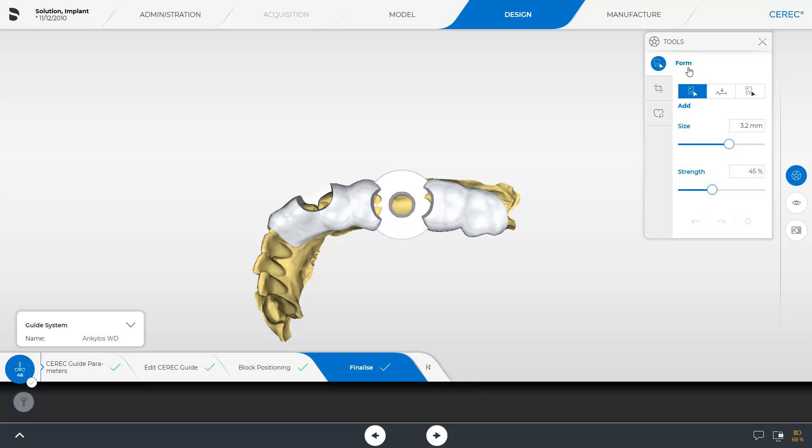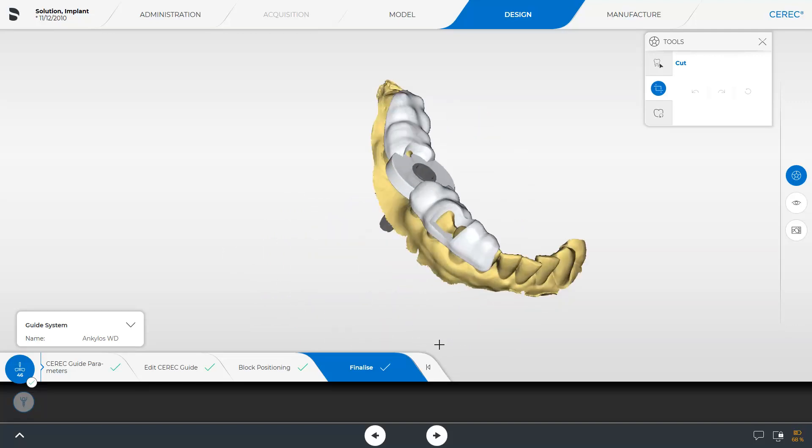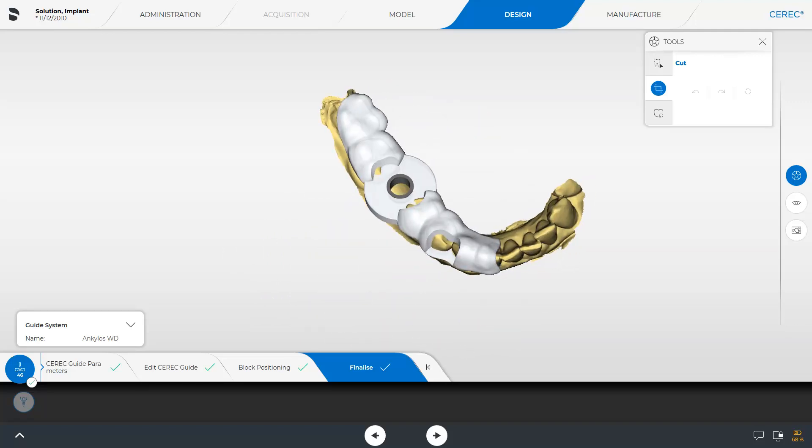We move on with the Cut tool. This tool allows for final shortening of the surgical guide. For demonstration purposes, we place a centered cutting edge on one of the front teeth. We start with a double click and confirm the cutting edge with an additional double click.